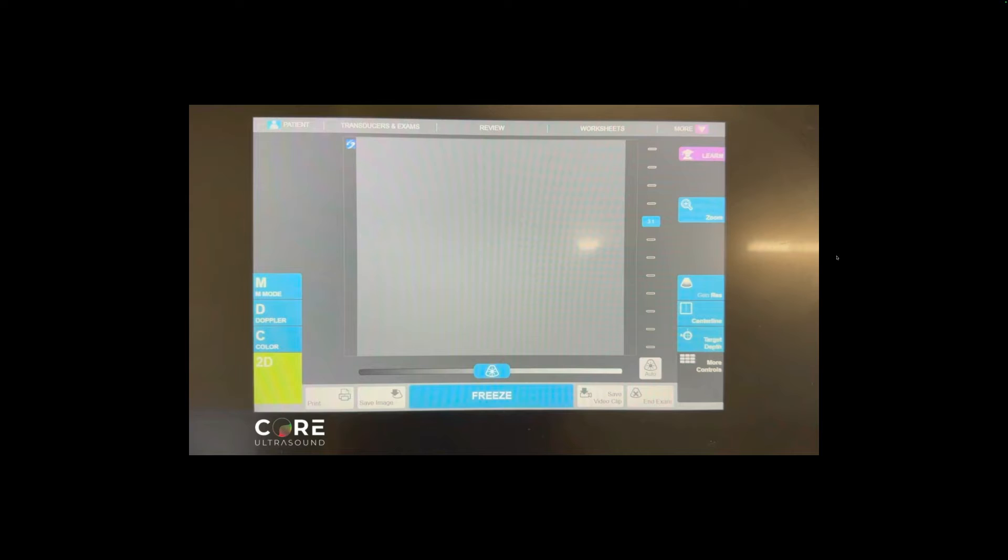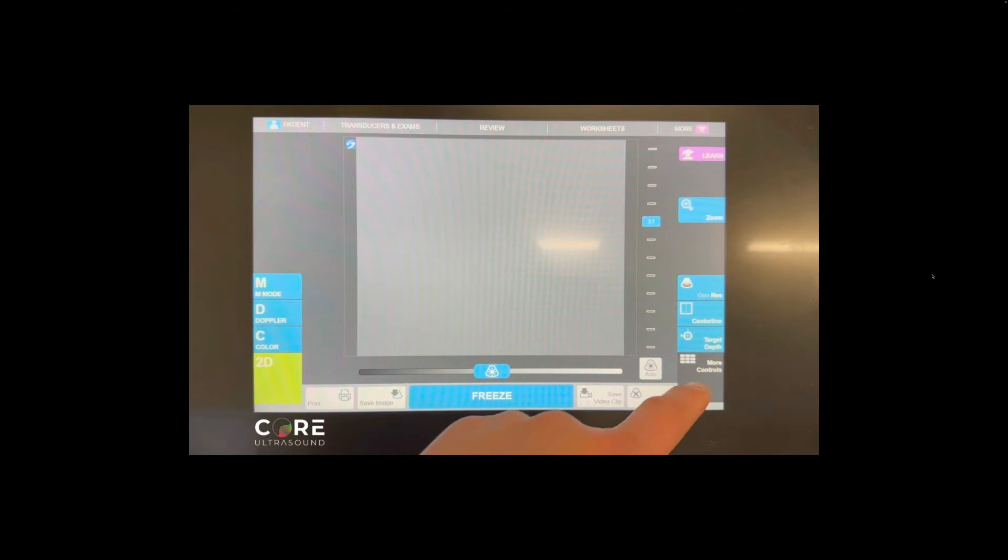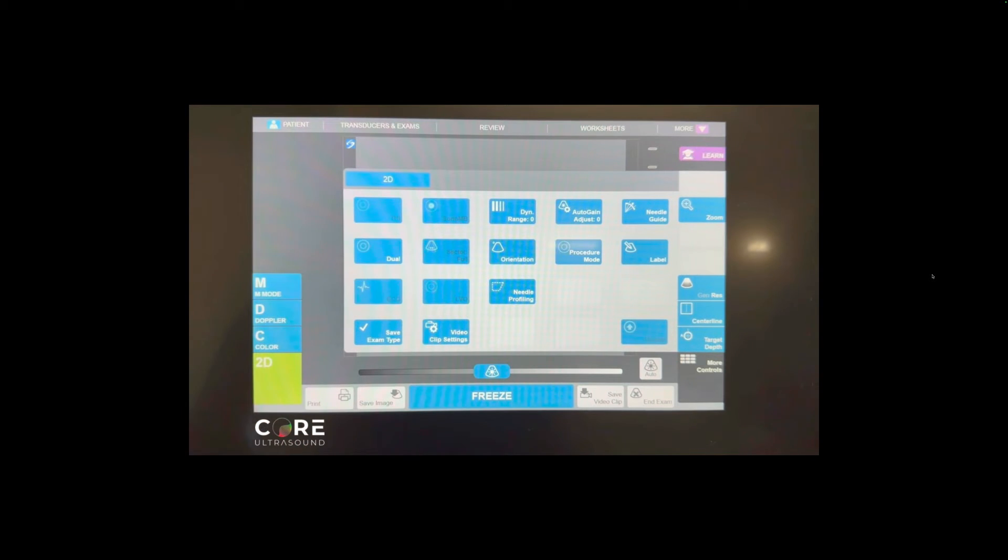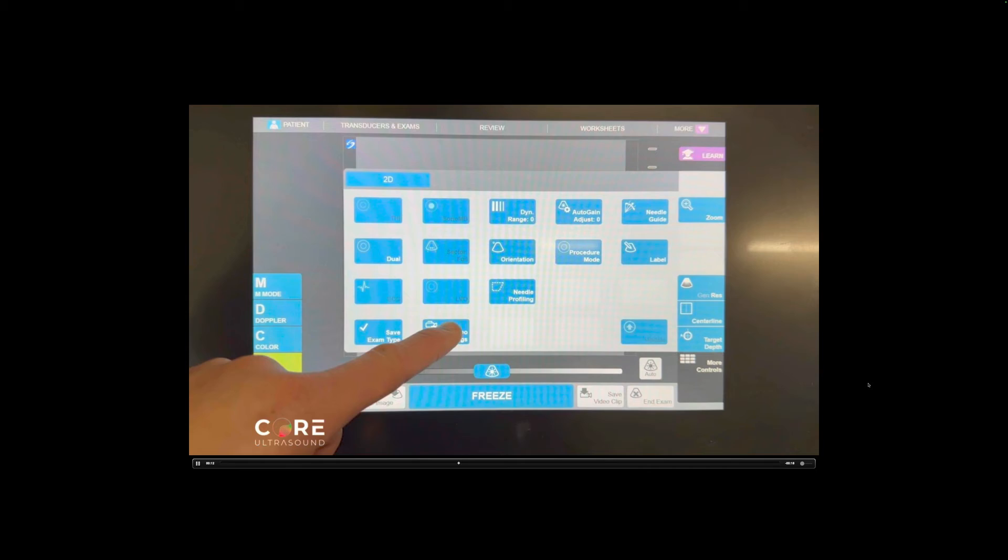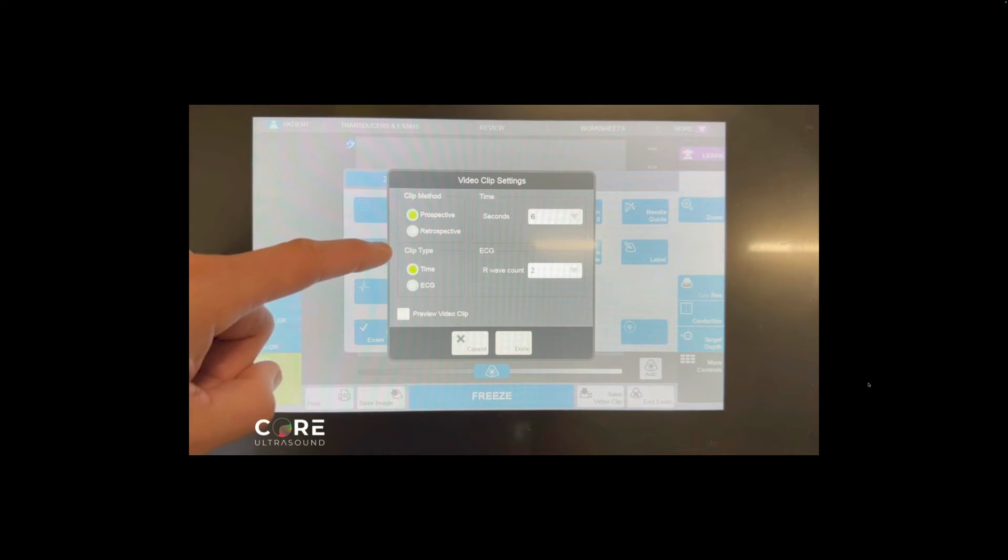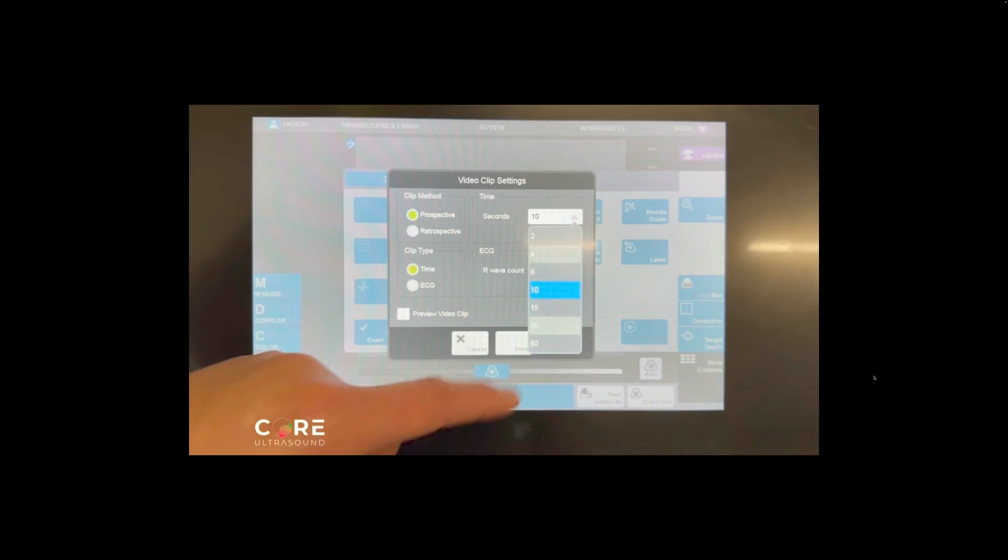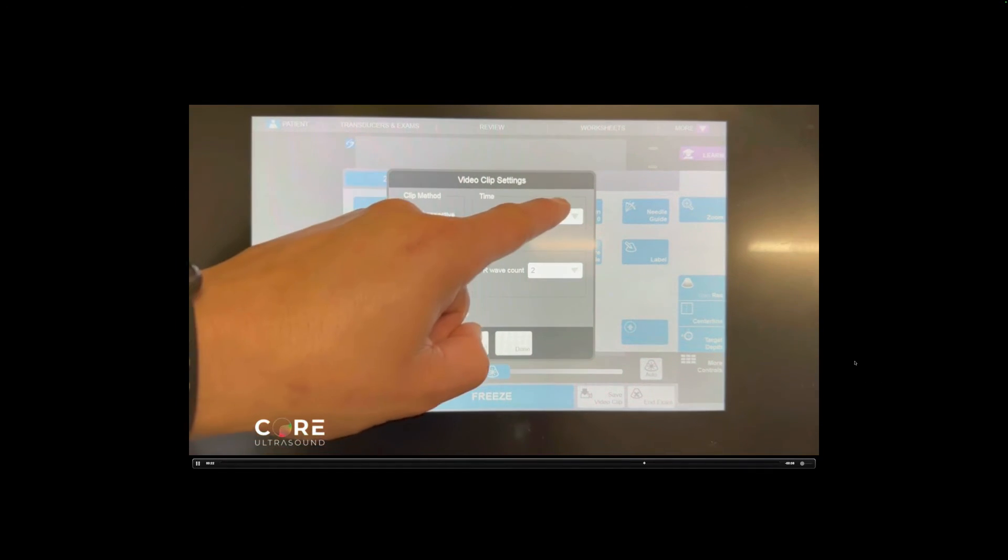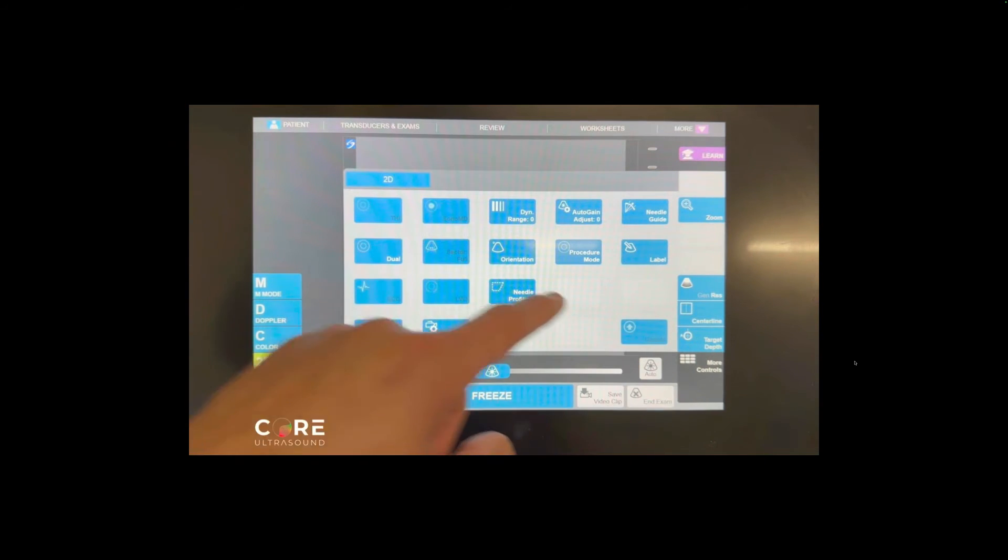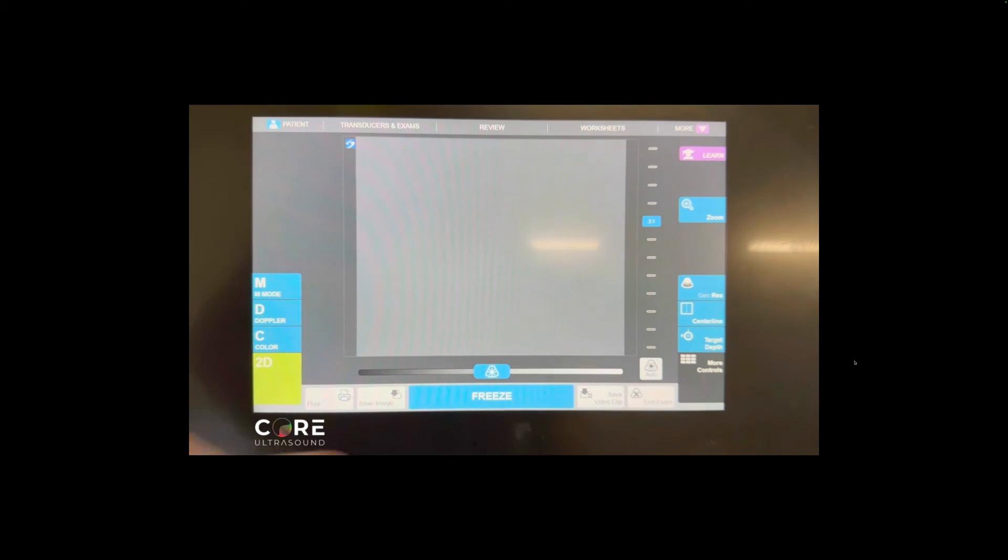Now, before we move on, one more thing that I want to discuss is making sure that your recordings are set to the right settings. And just in case they're set to like two second clips, which are not enough to really tell anything, or they're retrospective clips, which can be quite annoying actually, when you think they're prospective clips, let me show you how to fix that. So you click the more controls button on that bottom right, right there. And then you're going to click on video clip settings. You can see it there on the bottom left of the screen. And then you can adjust retrospective prospective, and you can have the time all the way up to 60 seconds. If you'd like, I really only use those longer clips of 60 second clips when I'm doing specific procedures, because I don't have the ability to like hit record every six seconds.